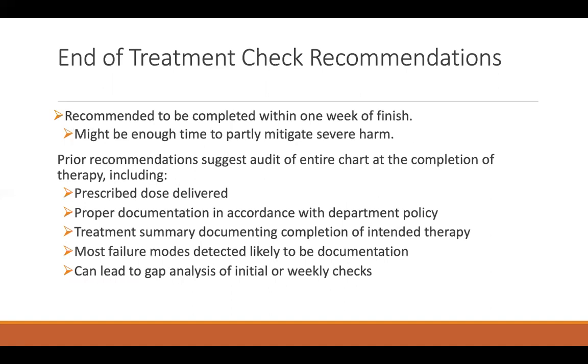Prior recommendations suggest audit of the entire chart at the completion of therapy, including prescribed dose delivery, proper documentation in accordance with departmental policy, and treatment summary documenting completion of intended therapy. Most failure modes detected are likely to be documentation related, and can lead to gap analysis of the initial or weekly check.